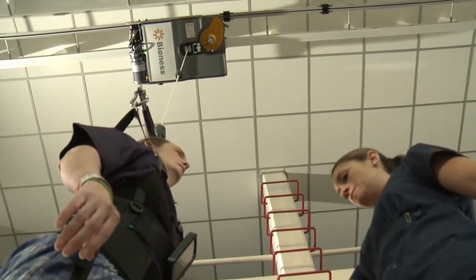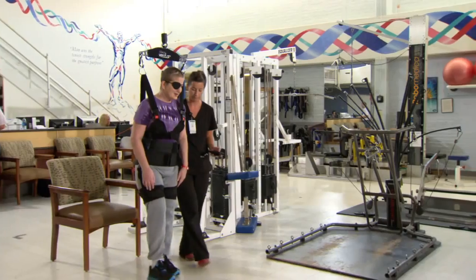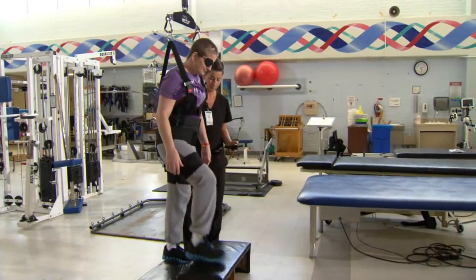Patients have been able to walk much farther than they have been over ground. So for some patients that are maybe going 10, 15 feet, they're now able to do 50 feet, 70 feet. For patients that are maybe minimal assistance over ground, they're now ambulating with supervision or with little hands-on assistance.